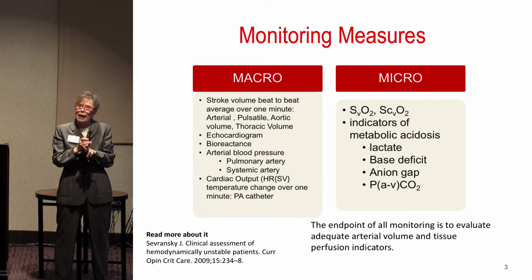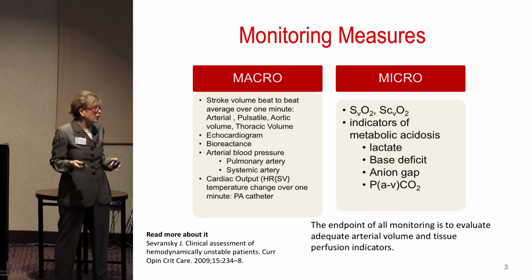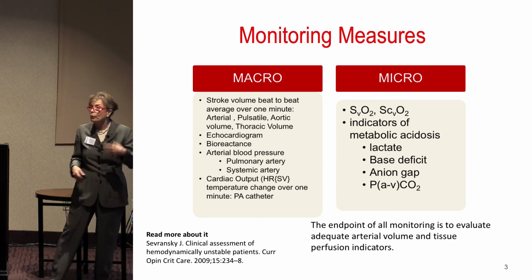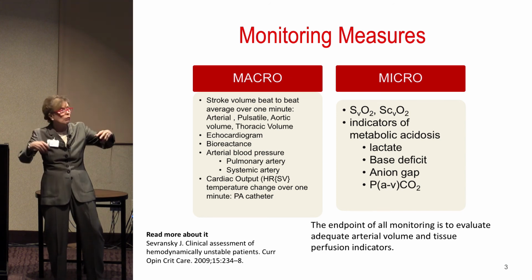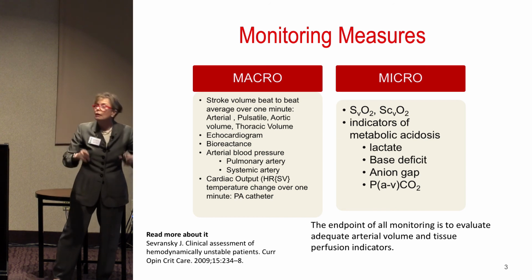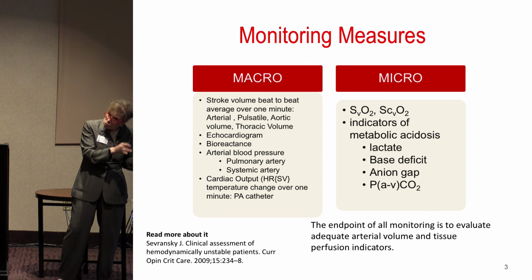There are so many ways that we can look at stroke volume. We can look at stroke volume in non-invasive methodologies, arterial-based cardiac output, either calibrated or non-calibrated, whatever it is you're using, PiCCO, LiDCO, FloTrac, CHEETAH, whatever you're using, all of that is good, and appreciating that you're monitoring stroke volume.